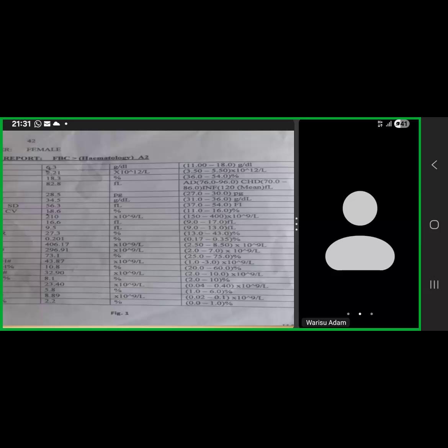And I was happy when someone queried CML from the beginning, but nobody is trying to speak to that. Querying CML. If you query CML, what do you see on peripheral blood? I keep saying that. What do you see on peripheral blood?